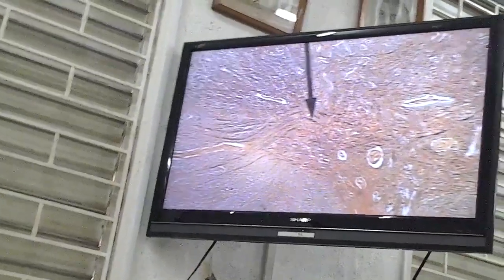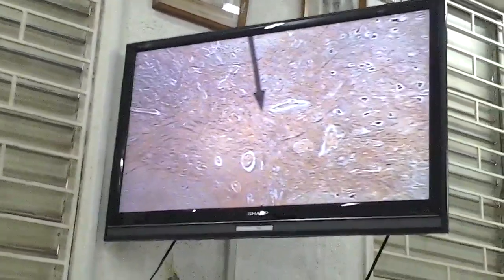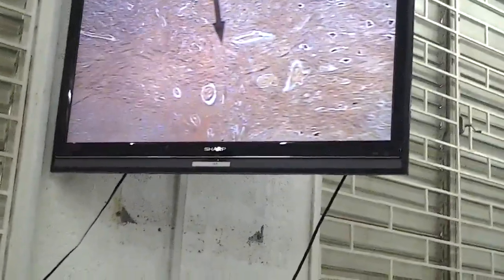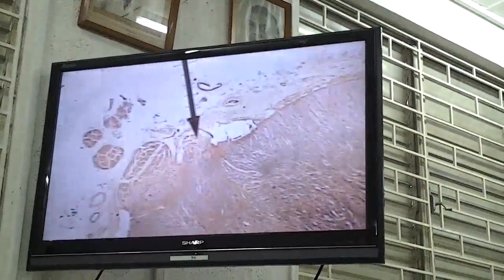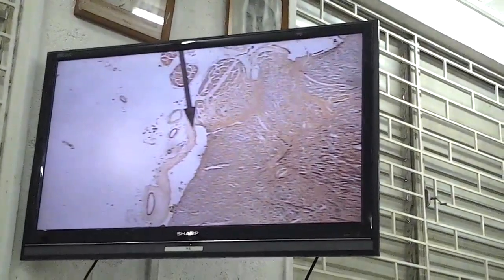Those are the dorsal horns. They can ask you, maybe you have a section like this. That's the dorsal horn on this aspect, and that's the ventral horn on this aspect, because of the presence of the multipolar neurons. Over here, this is going to lead us to the nerve, and sometimes you can pick up the dorsal ganglion.